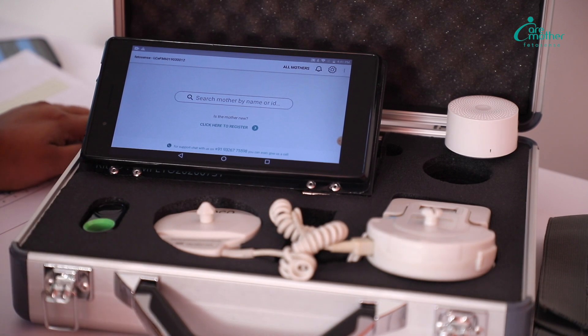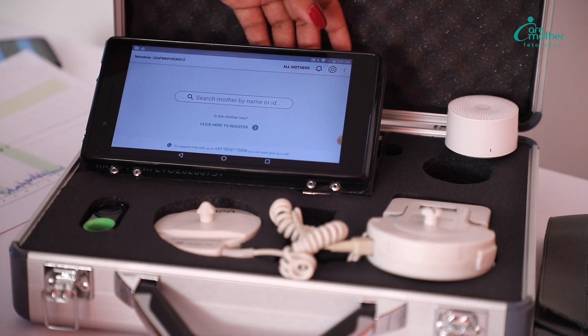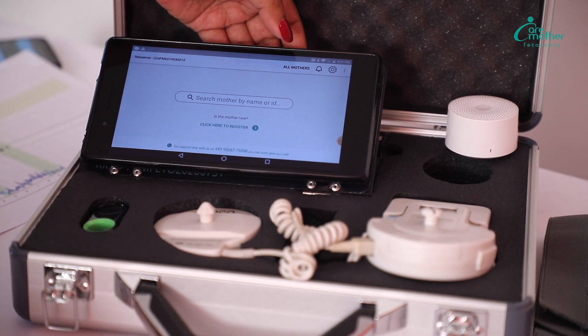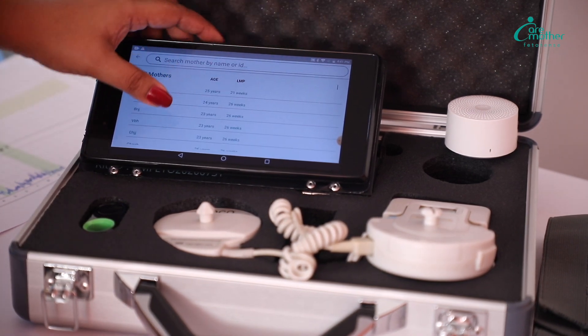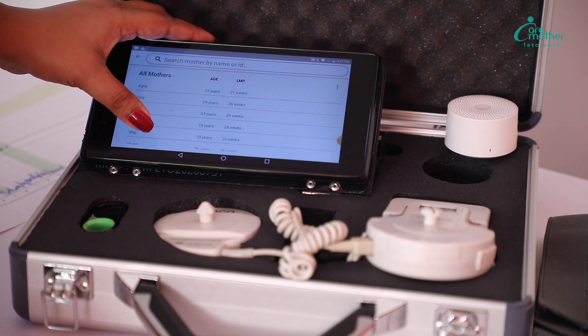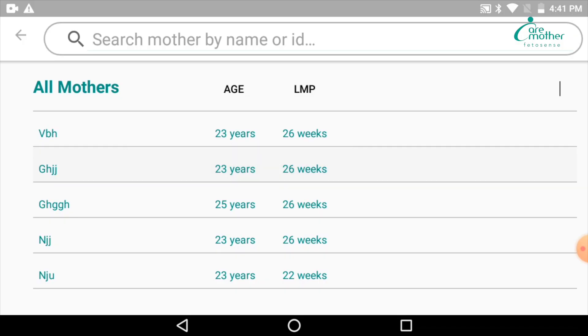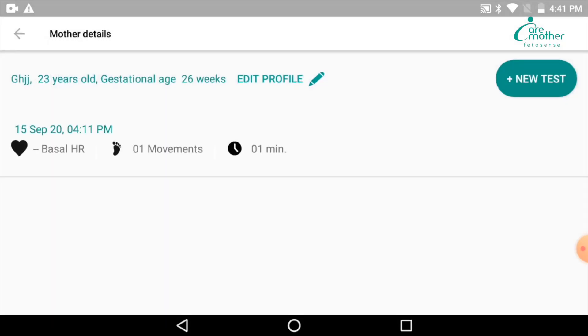At any point in time you want to edit any of the patient's profile, you can always go back to the All Mothers tab, select the profile you want to edit. You can click on this pencil on the profile and you will be able to edit the patient data.